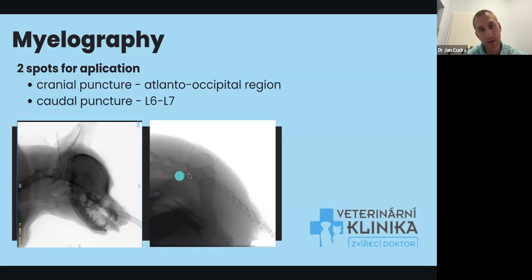There are some big spinal roots, there is a region of cauda equina. So there is not a big issue to damage the spinal cord, you should be careful, but there is no big possibility to damage something. And how we can perform it, we can go through the presentation.